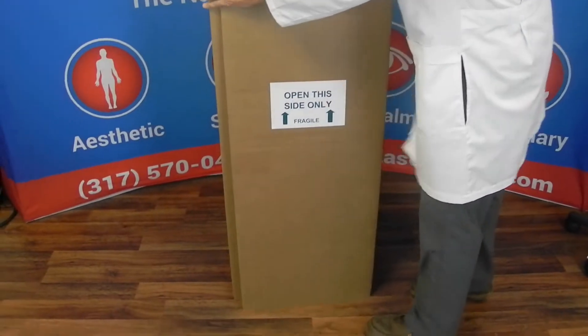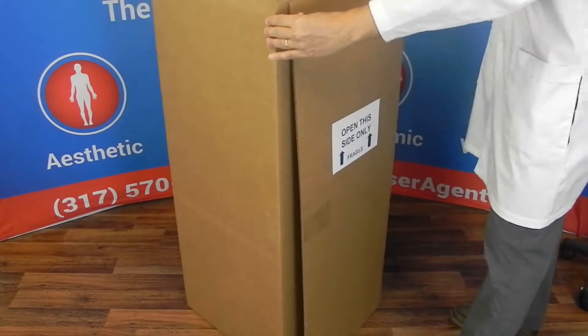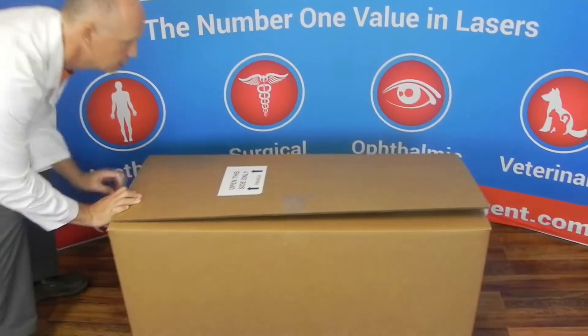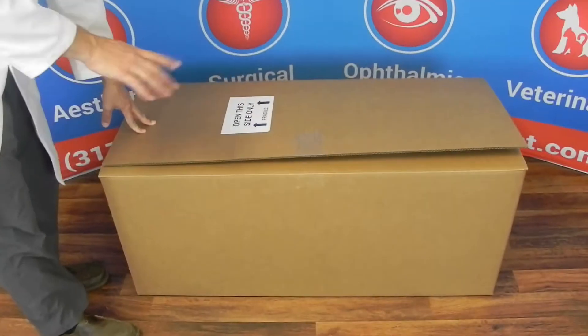It'll be labeled which side to open. Make sure you open just the side that says 'open this side.' Go ahead and lay the box on its back. It will be all taped up, so just cut the tape — don't cut the cardboard, just cut the tape.